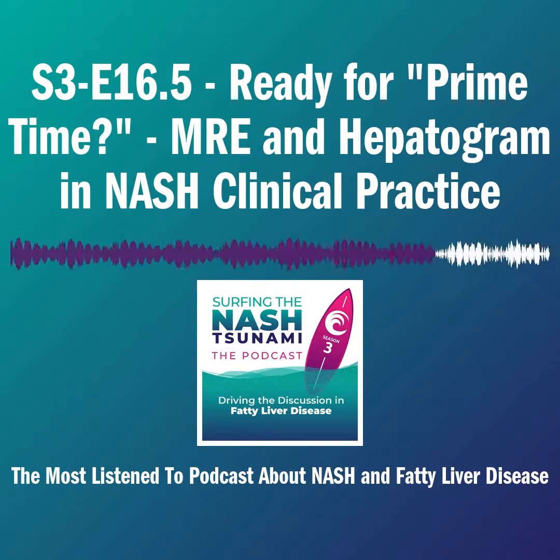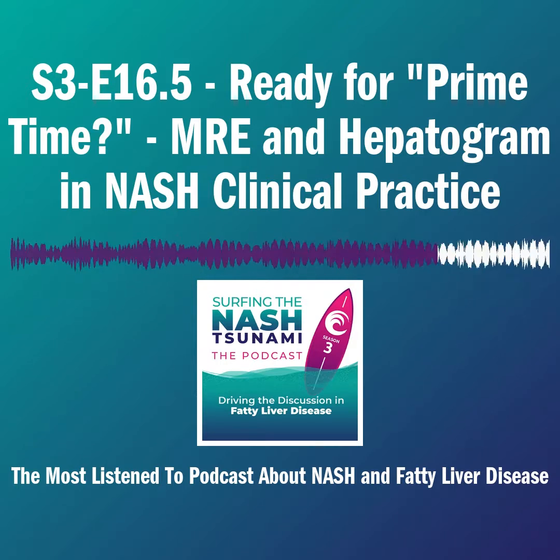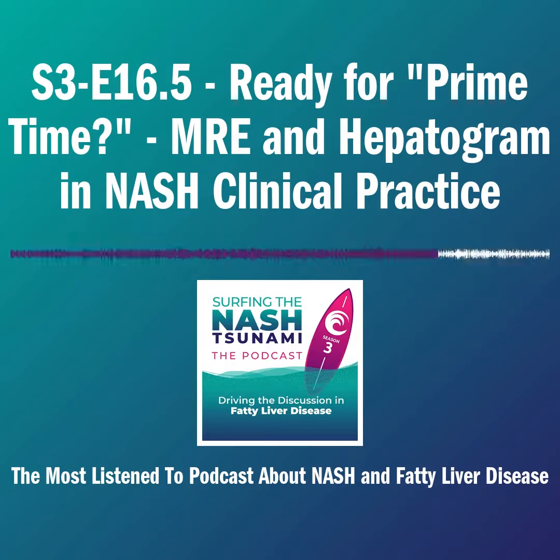But with PDFF, actually, this is one thing that people don't talk about, is that you also get liver iron concentration for free, all in the same breath hold as well. So really with the hepatogram that we've been talking about, or the MREFF, we should really call it MREFF LIC, you get stiffness, you get PDFF, and you get liver iron concentration as well.